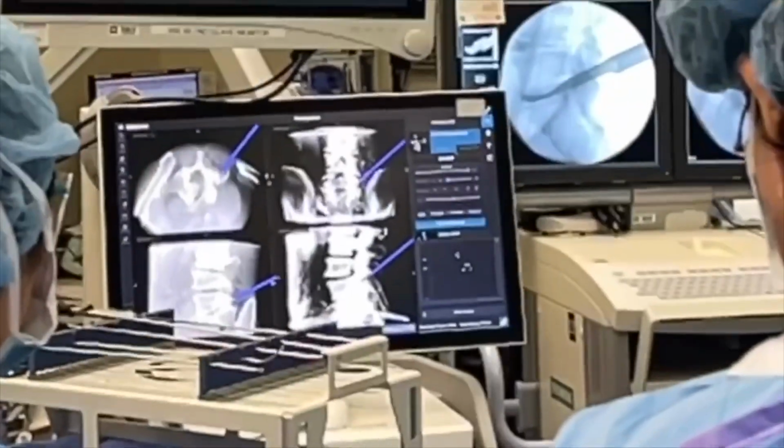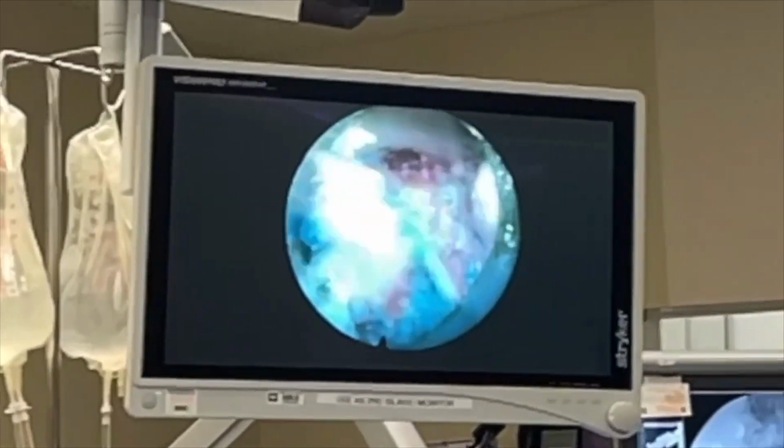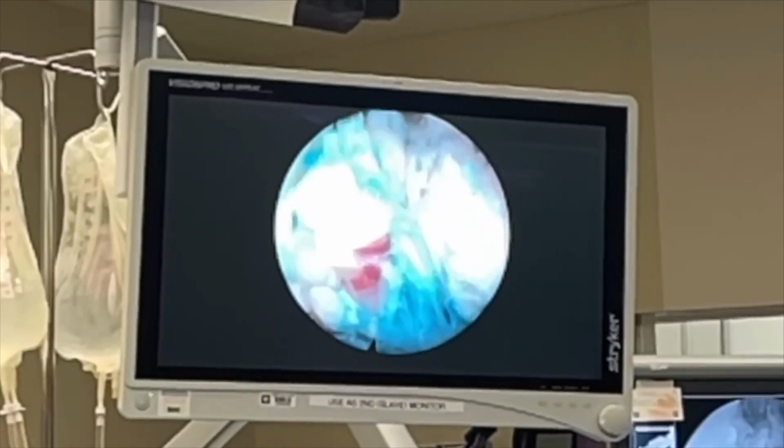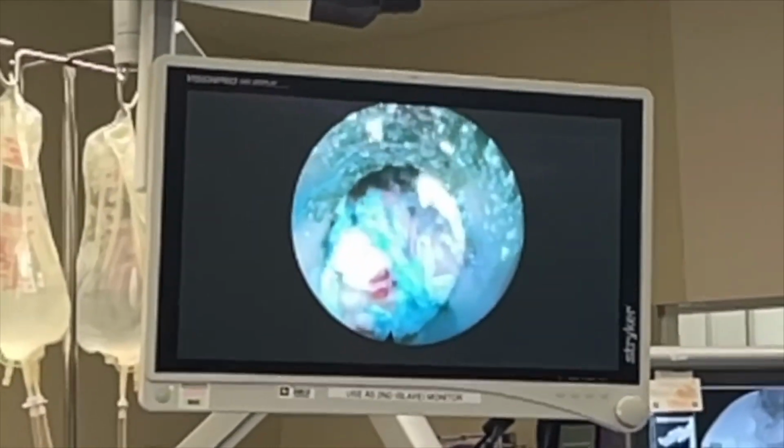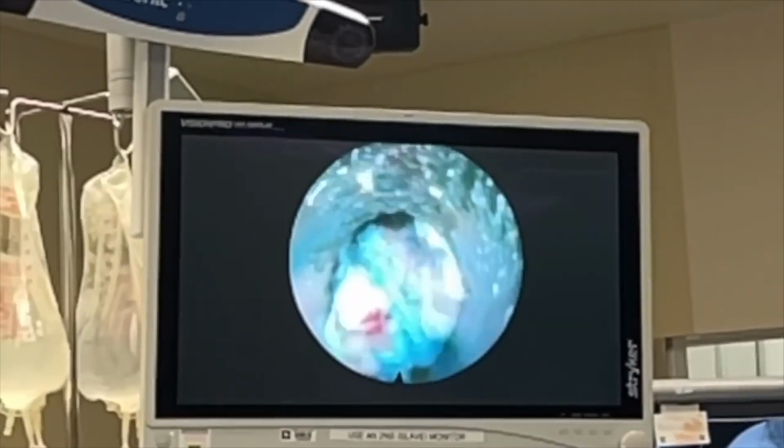So I'm getting the lateral bone right here. I'm going to shave that off and get in there. Okay, there's the bony tunnel right there. The exiting nerve root is just right there. Oh, look away. Right there. Oh, scary and sexy all at the same time.